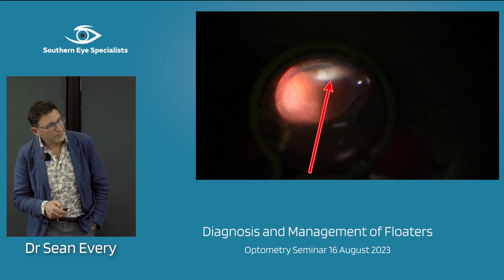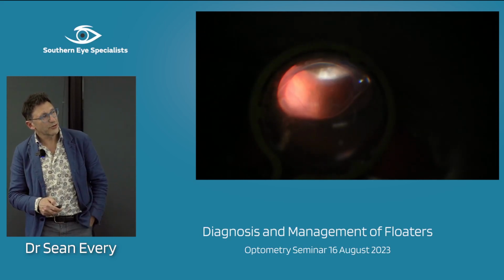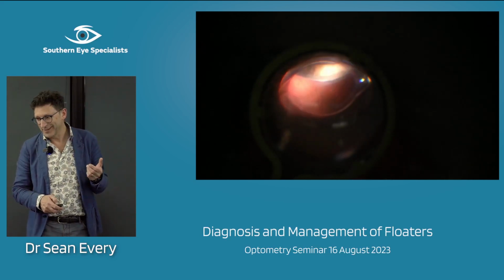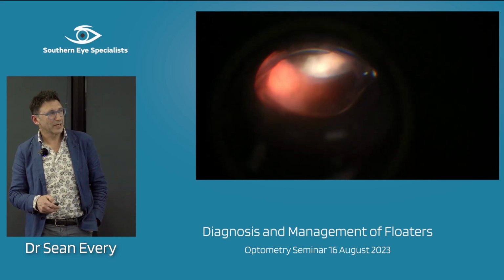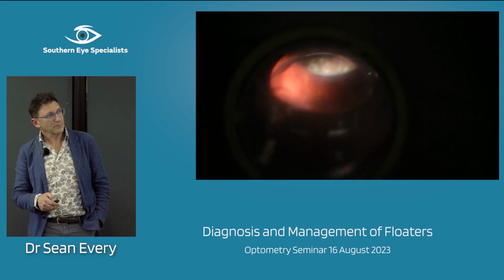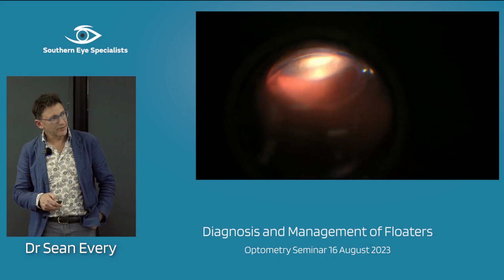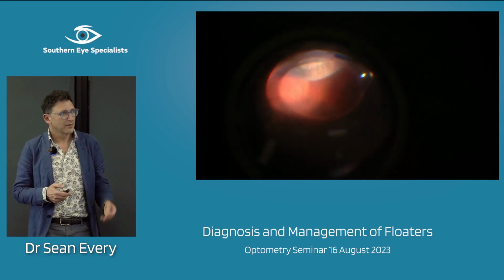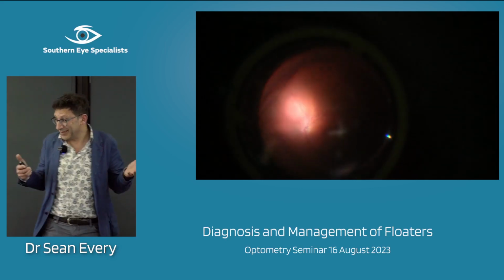See, this is over the pars plana. There are just all these little inflammatory dot infiltrates sitting there. You'd never see them until you do an indented exam. It's going to come into clearer focus soon. See them there? Bang, bang, bang. Look at that. That's just low grade, doesn't need any treatment at all. It was treated 10 years ago, but it's been sitting there dormant, basically.